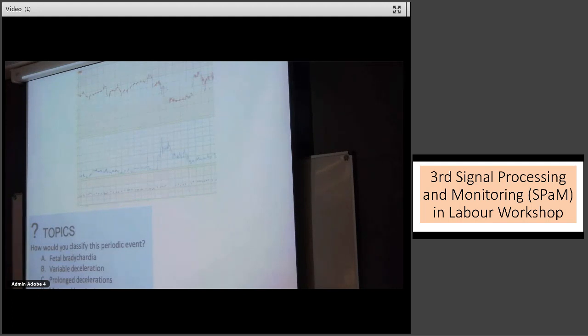And please tell me, because maybe you are better than I am. If you look at the ECG waveforms, maybe you can distinguish. So if we have access to the waveforms, we can look at this and say this is fetal or this is maternal. Okay, so yes, you can answer this question if you look at the morphology. Okay, so my point is, when we use electrodes, the likelihood of getting maternal is much lesser, but it can be, and for prolonged time. Okay, my message.